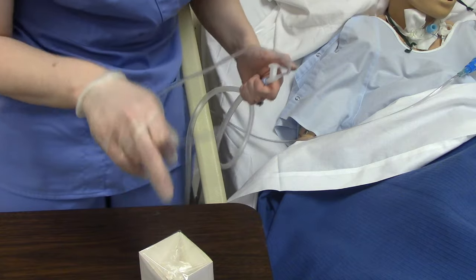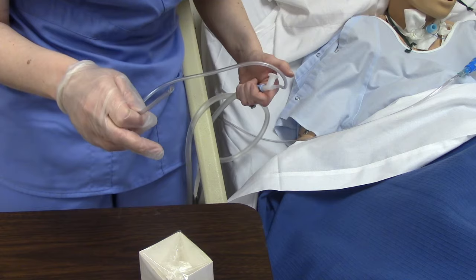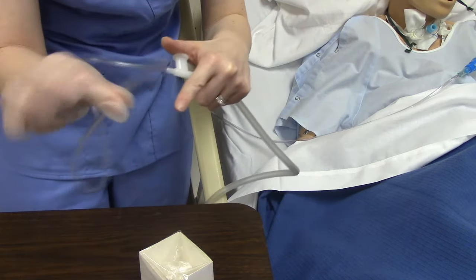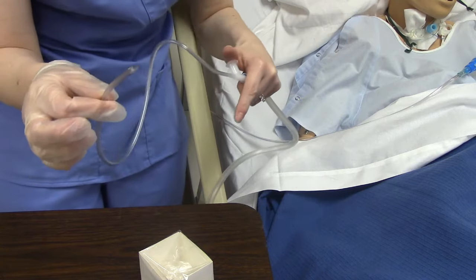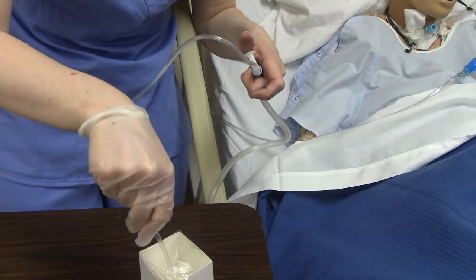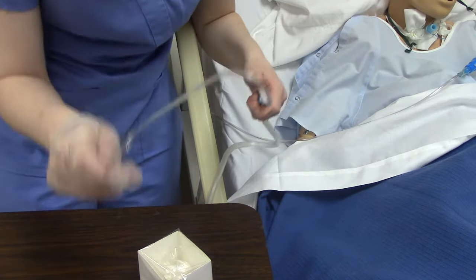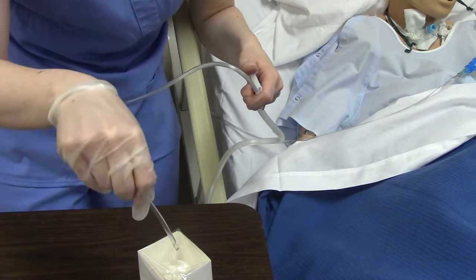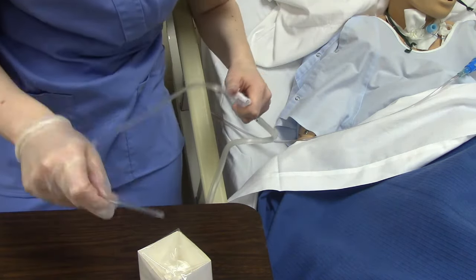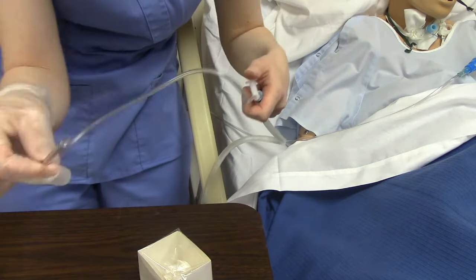What about the little box of normal saline? This is only needed sometimes — if the patient has big, thick secretions you want to help break up, or if you get a lot stuck in the tubing during suctioning, which makes the tubing not work as well. What you do is suck up a little bit from the box and it cleans out the tubing. We will never instill any normal saline into the patient's trach — we are not putting this in their body. This is only used to clean the tube.